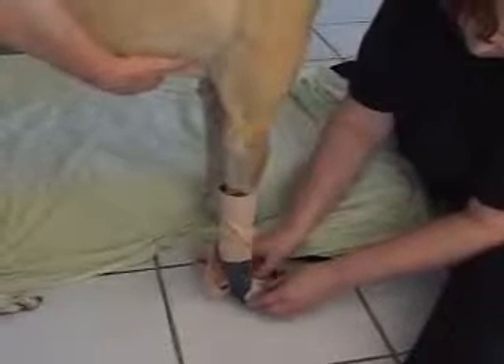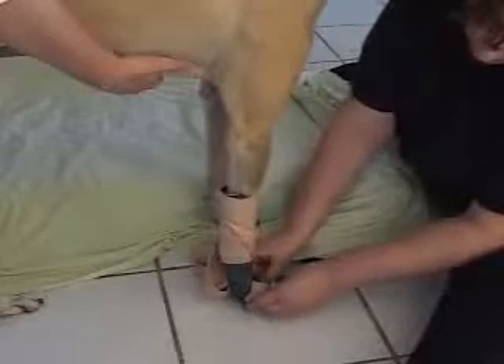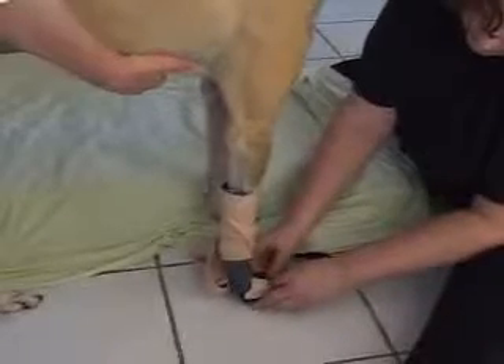Hold the animal and the splint in place until the splint material cools and hardens. This should take less than a minute. Once the splint has hardened, lay the animal back down.